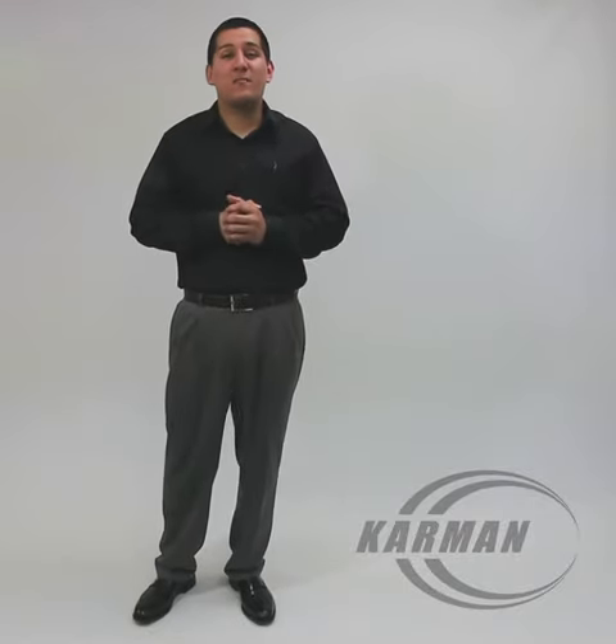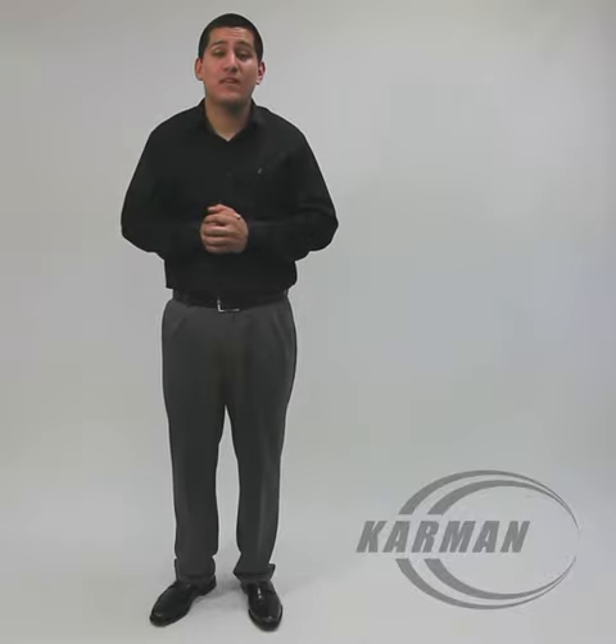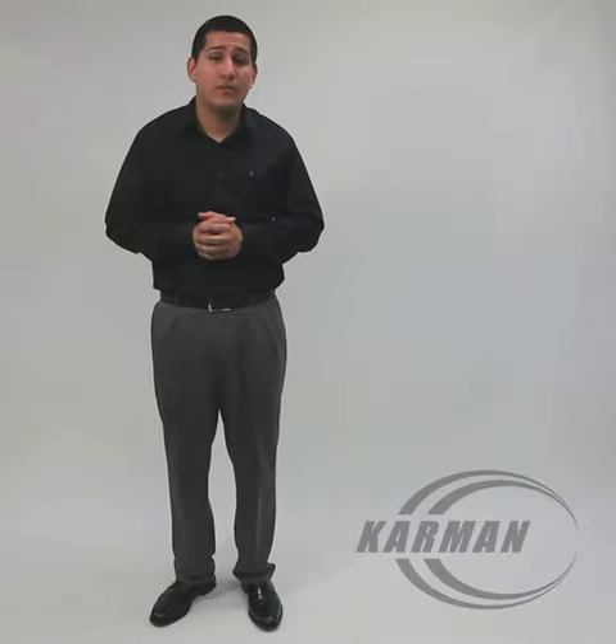Hello everyone, Edward here with Karman Healthcare. Today's transporter I will be talking to you about is our T2700. This is a steel frame transport chair. It weighs approximately 23 pounds.